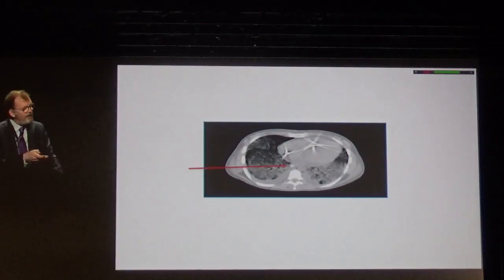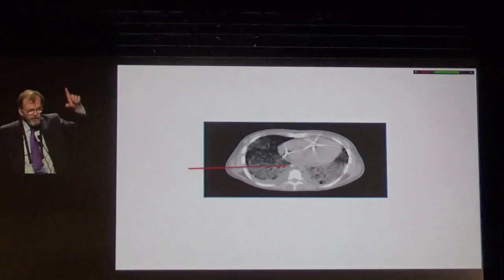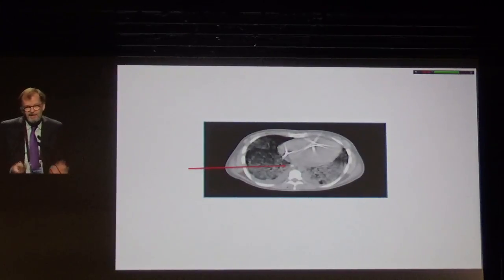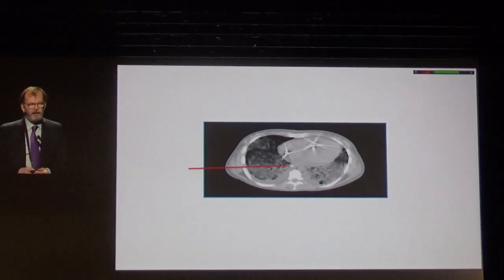So this is where is the lower pleural pressure, to the dependent part, and this is where is the highest values of pleural pressure. So there is a clear gradient, so the esophageal pressure is just one pressure. It cannot give you the whole gradient. It gives the pressure where it is located.